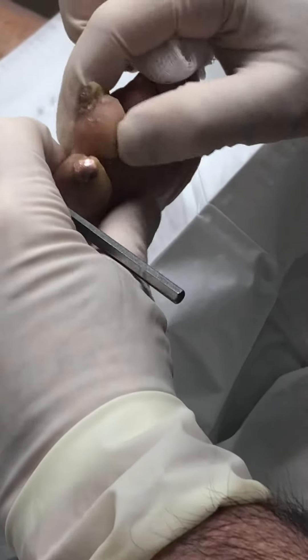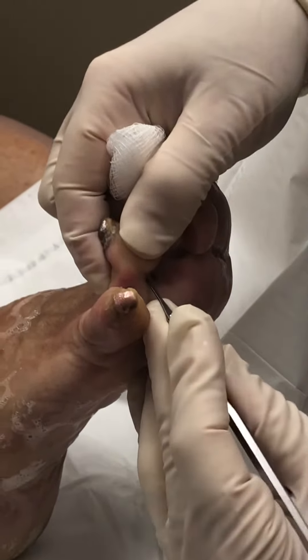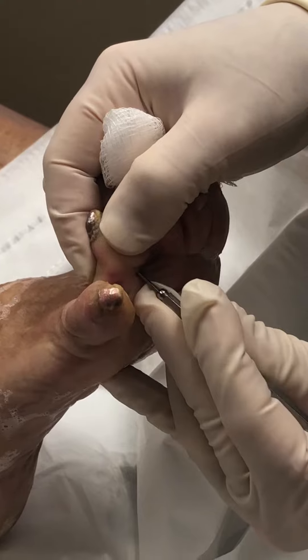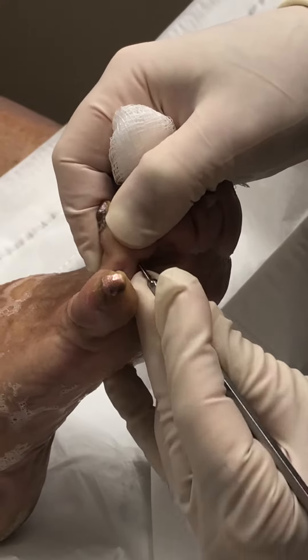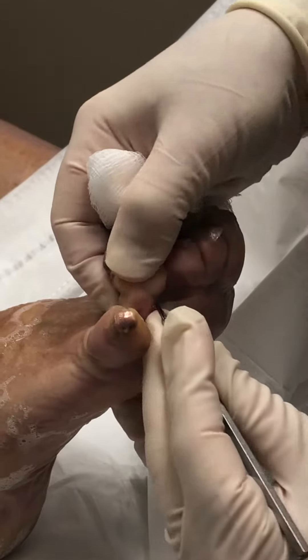Let's see if we can get this toe out of rotation and straighter. It's a little better — let's see if we can get a little more release. It's a little better.